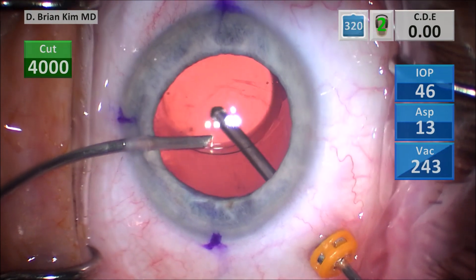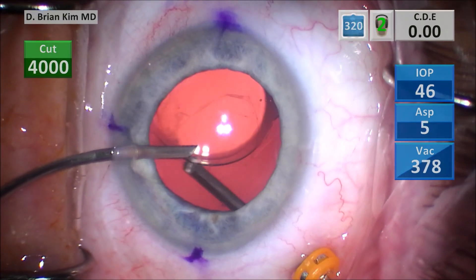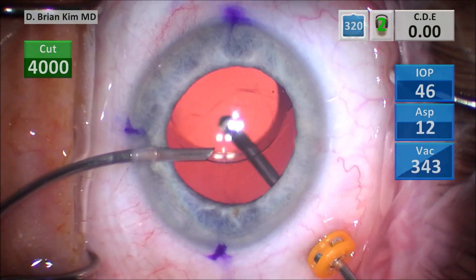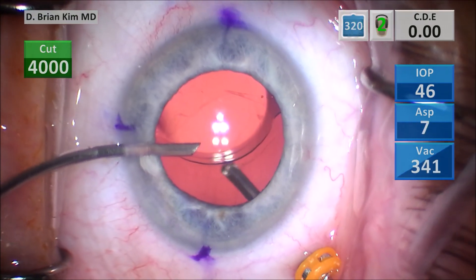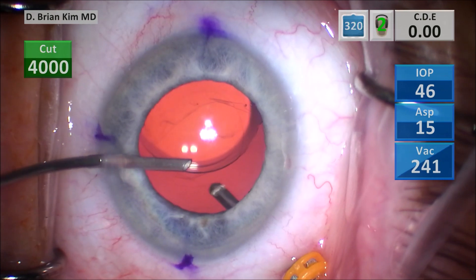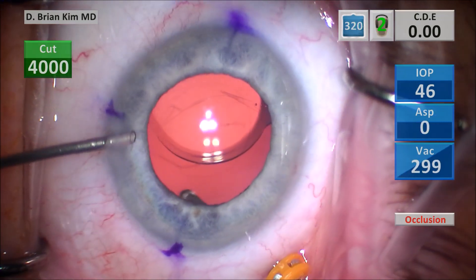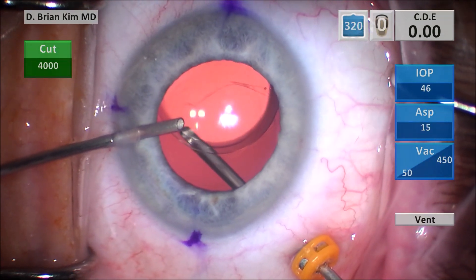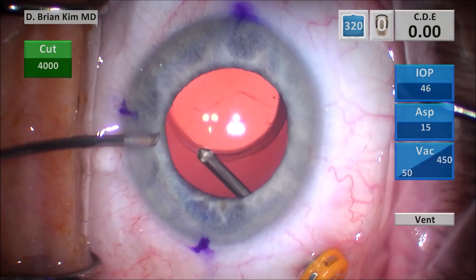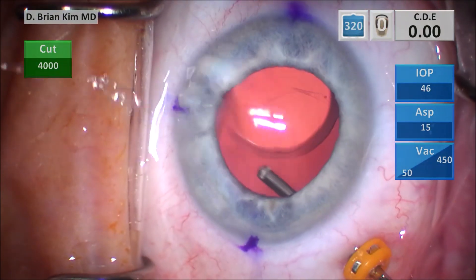I start the vitrectomy. You can see all that vitreous in the anterior chamber starts coming out very quickly. The vitreous in the anterior chamber is more opacified. For the anterior vitrectomy setting, it's high cut rate with high vacuum. I'm sweeping with the cannula right over the vitrectomy port to help facilitate vitreous removal in the anterior chamber. There are a few fine fibers at the level of the infusion cannula, so I pull the cannula out to facilitate removal of the vitreous in that area.